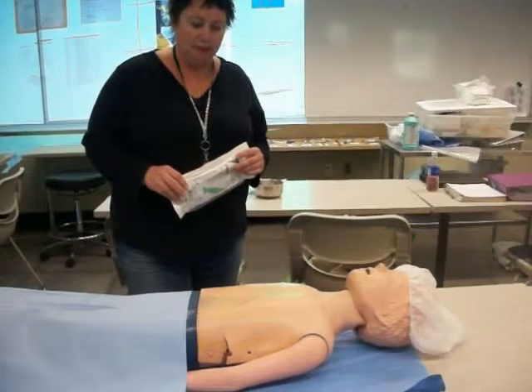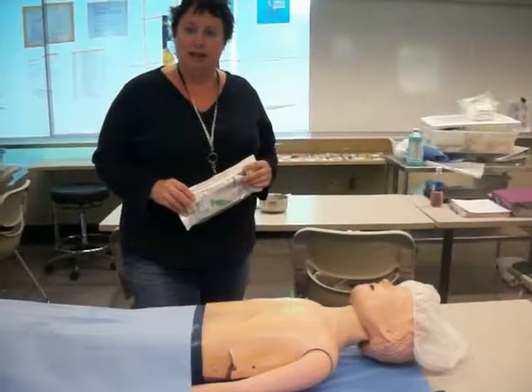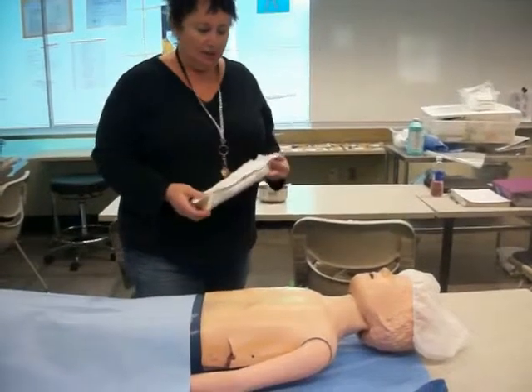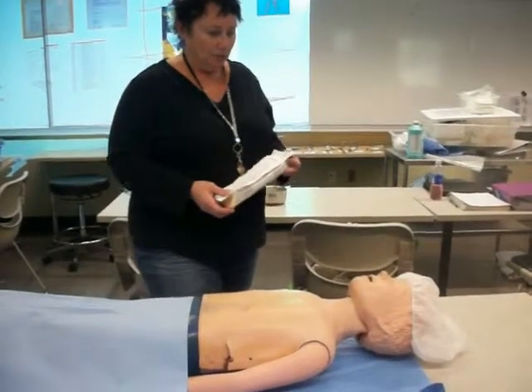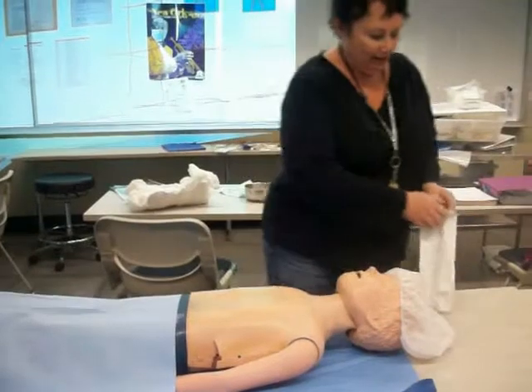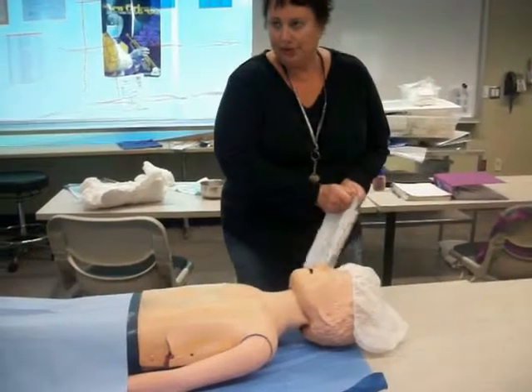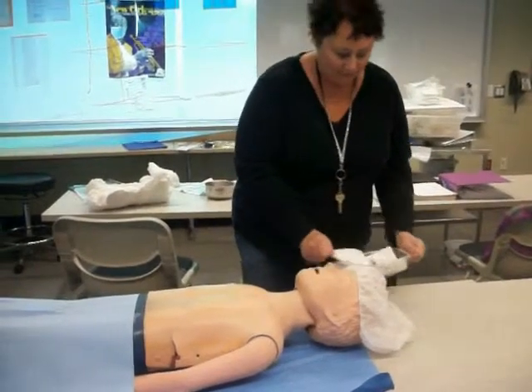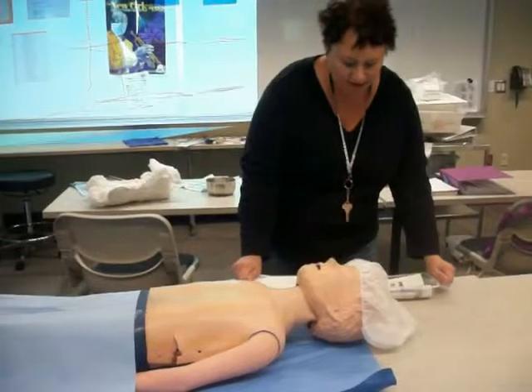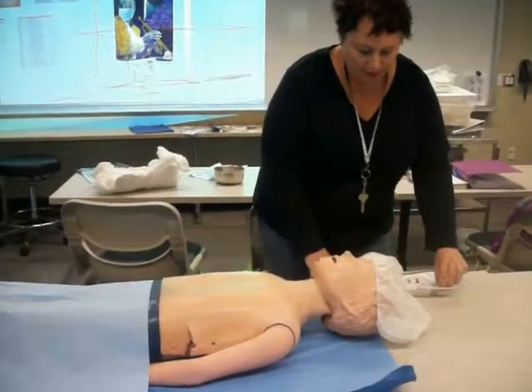Our parameters for abdominal prep are bedline to bedline, nipples to pubis. The first thing I'm going to do is open the kit, and you don't have to wear gloves with this — you just have to be careful not to contaminate it.